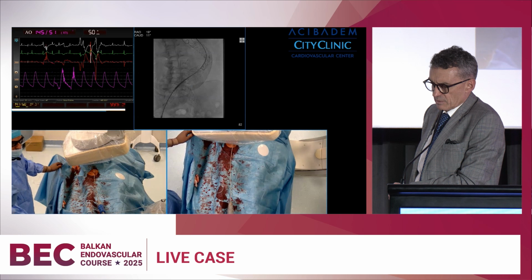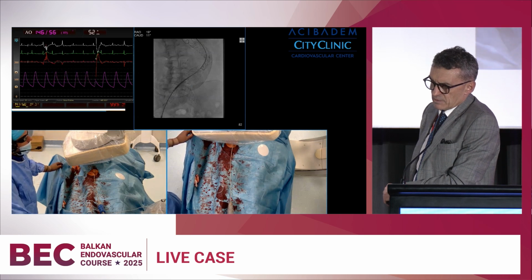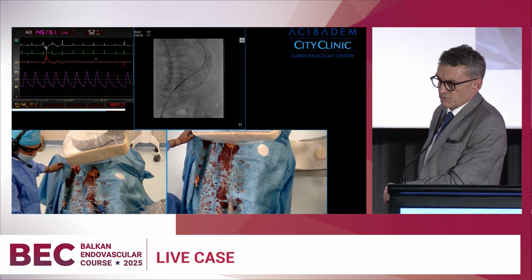And you can, the pigtail is over there. Yes, already, so you can inject.